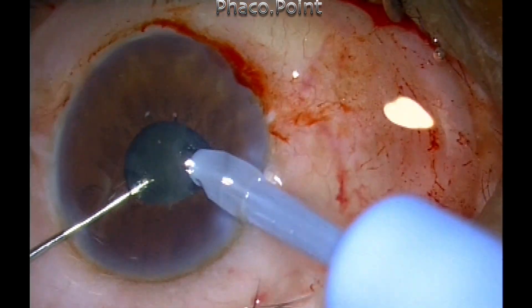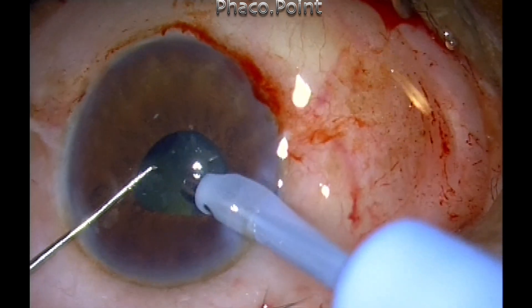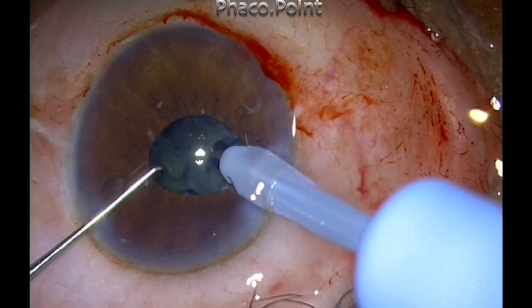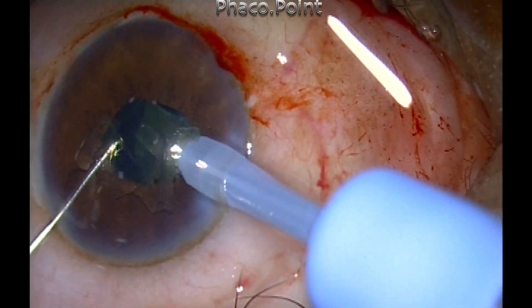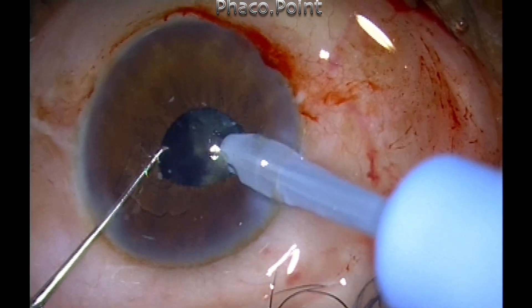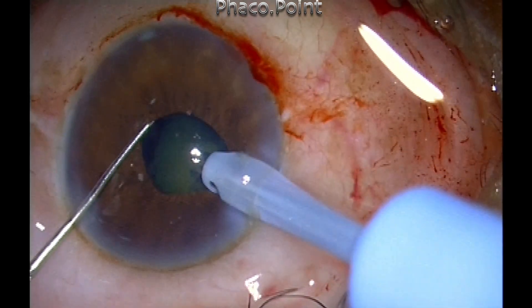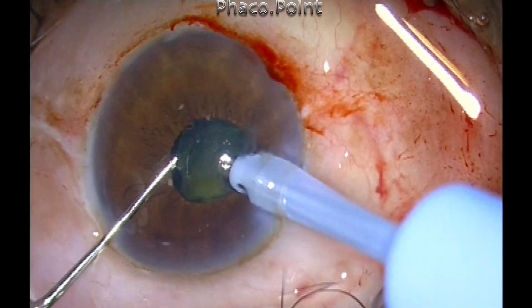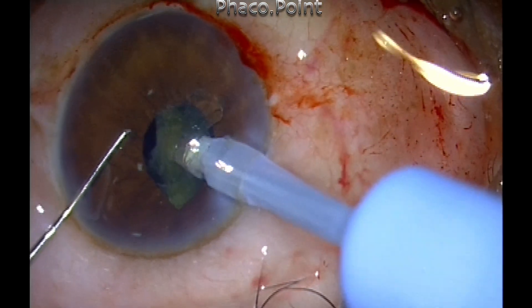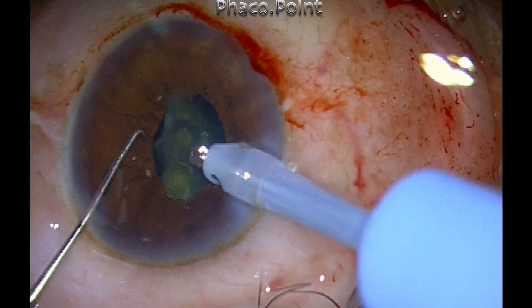The vacuum, aspiration flow rate, as well as emulsification with the application of intermittent power is enough to propel the pieces towards the phaco probe. The phaco probe is not going towards the pieces — it's the pieces that keep coming towards the phaco probe and getting emulsified. This is possible because of the fluidics of any machine. Just rely on the aspiration flow rate and the vacuum to bring the pieces to the phaco tip.